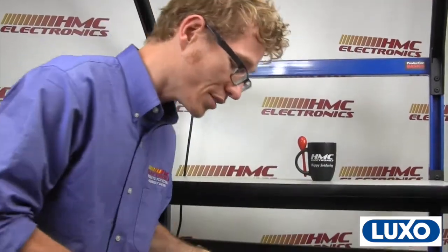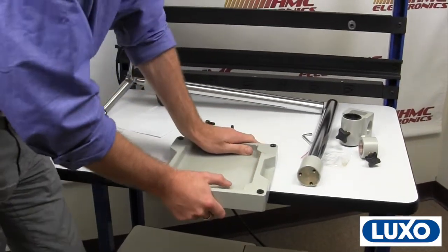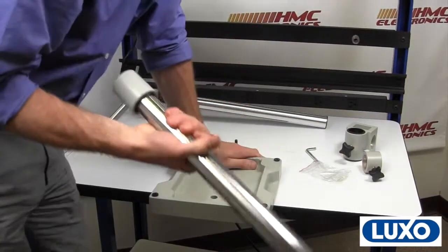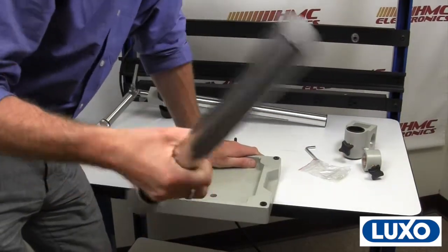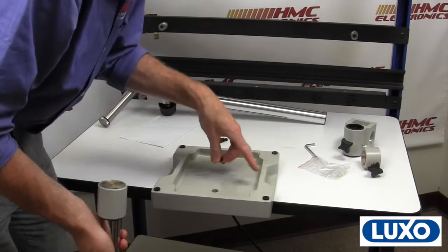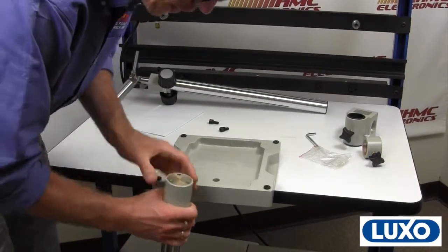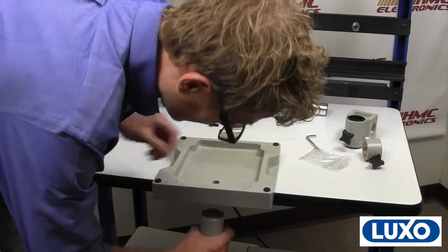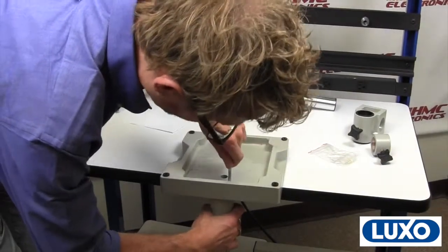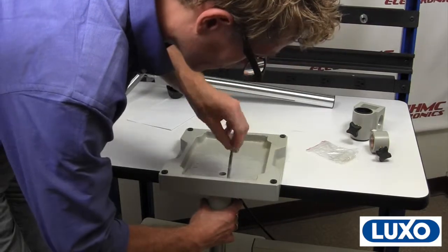A quick tip on how to assemble the vertical post onto the base plate: put about two-thirds of the base plate on your workbench so it doesn't fall on your toe. I have removed the cross block and the locking collar from the vertical post. Rather than try to manipulate the heavy base stand, you can just position your screws in and the only thing you're then manipulating is the vertical post, which is a lot easier.